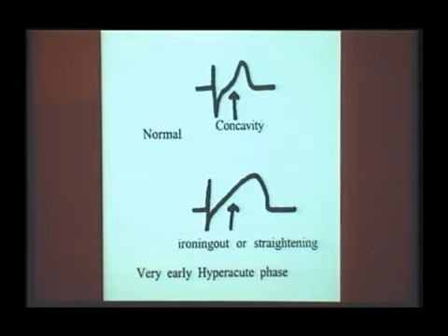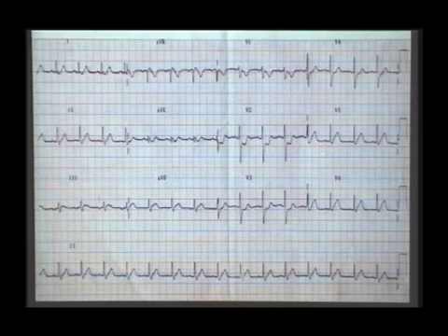Look at this ECG here. What is your diagnosis? What injury this is? Subendocardial injury. What treatment you will give? Heparin or aspirin. So this is what happens. So you see that V5, V6 and L2, L3 AVF. See, compare your ST segment of the V4 versus V5 and V6.